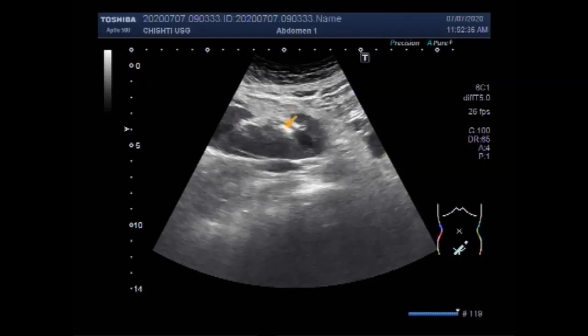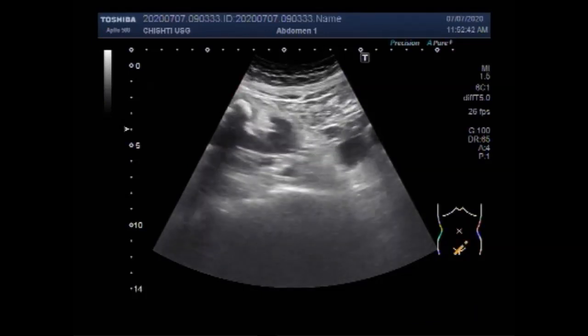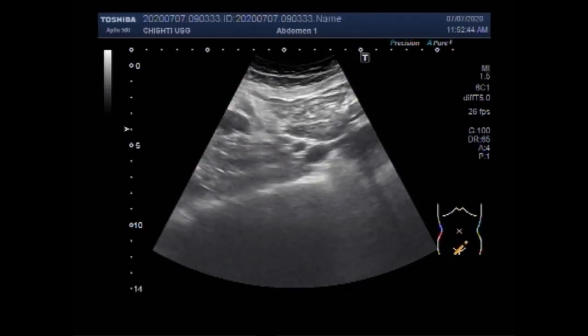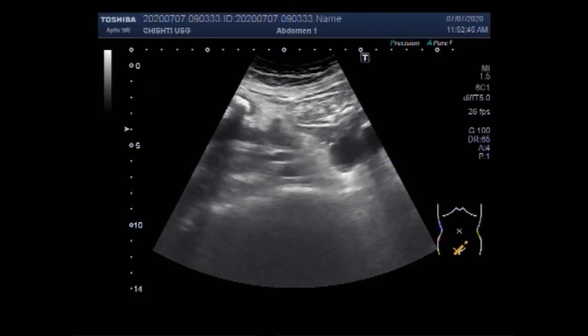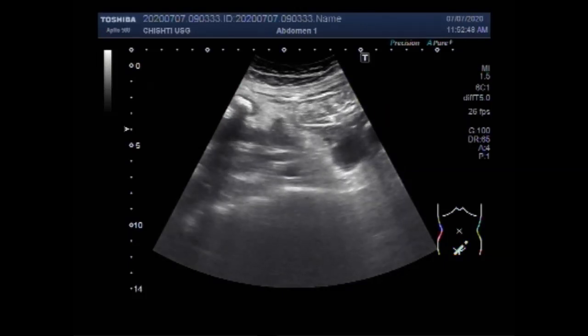The ectopic kidney is most commonly located in the pelvis. As in this case, the kidney is located in the left side of the pelvic cavity.